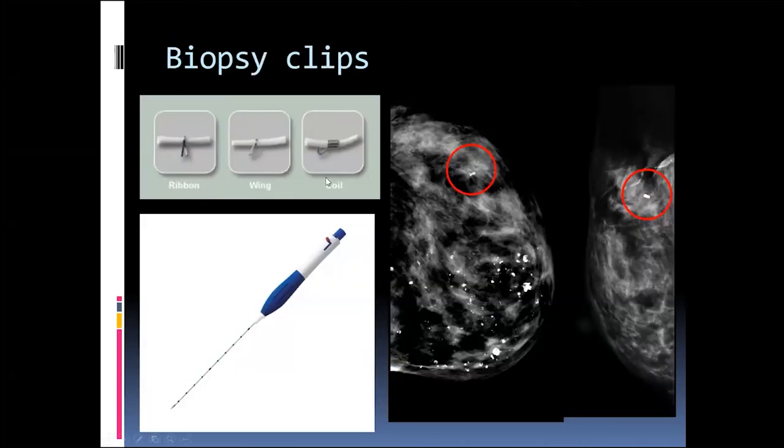Here are the biopsy micromarkers. They're in this device, and you use a plunger mechanism to plunge them out. They come in different shapes — ribbons, wings, and coils — and here's what they look like in the breast. At our institution, we actually call them 'breast bling,' which makes them sound much more attractive to patients.